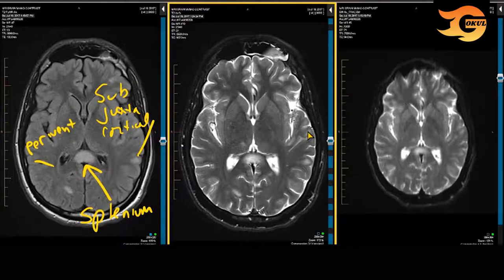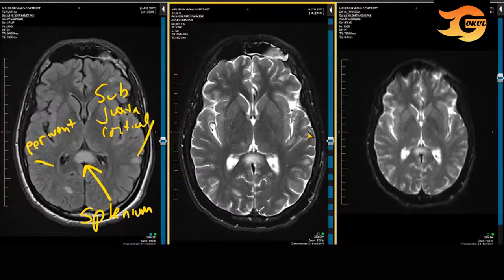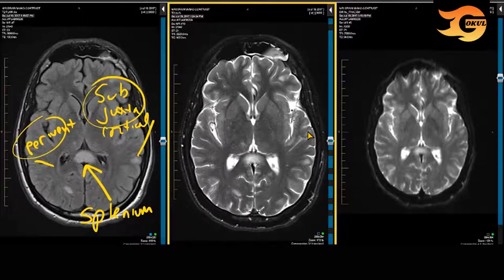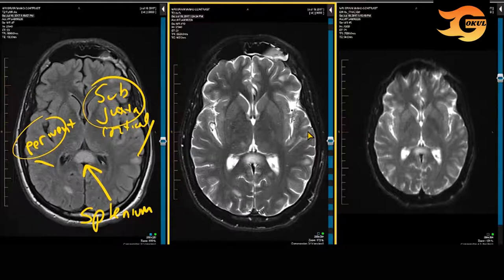When we talk about the McDonald criteria for multiple sclerosis, we have to look at four different locations. Number one, juxtacortical demyelination. Number two, periventricular demyelination. Number three, infratentorial demyelination in the brainstem and cerebellum. And finally, in the spinal cord. If two or more areas are involved, then it satisfies the McDonald criteria for dissemination in space within the central nervous system.